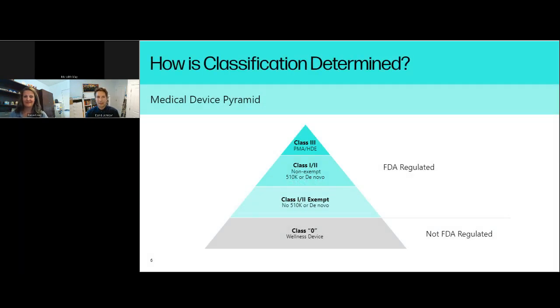We have some exciting things, and for those of you from the last webinar, this was a chart going over just the classifications. We won't dig into the explanation. Michael Drews in our last webinar did a very deep dive into what those look like. So at the very basic level, Dawn, what changes when you look at mechanical testing for a class as you go up from a class 1, 2, all the way to 3? It's a higher risk profile for the type of claim, but what needs to be there as far as mechanical testing on the actual part design?